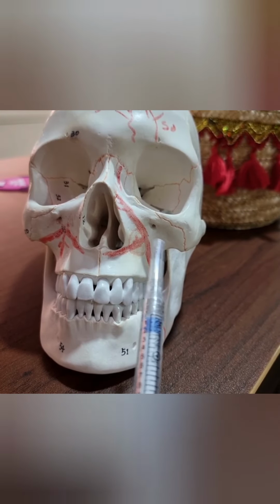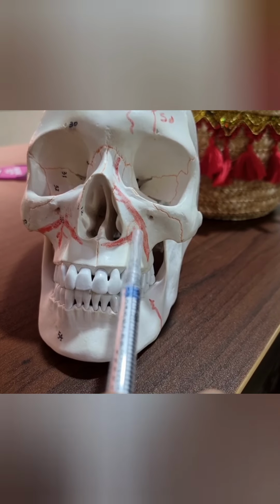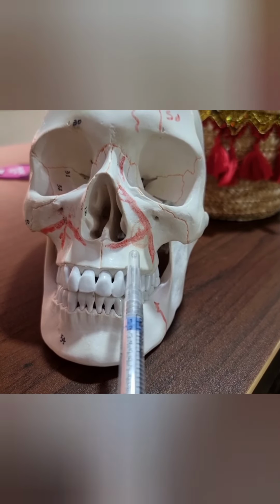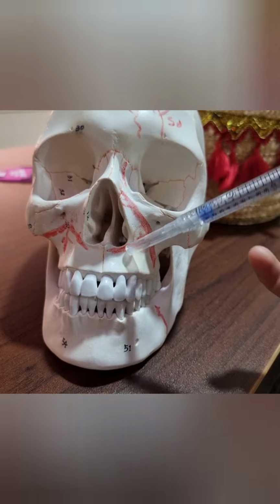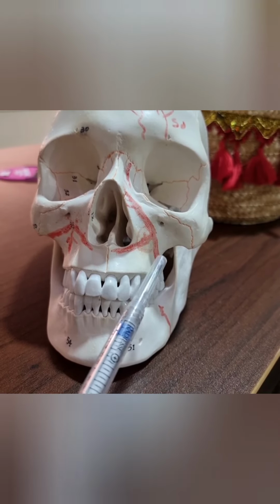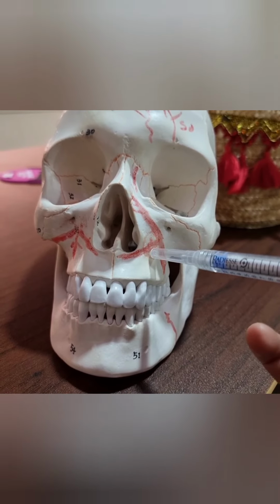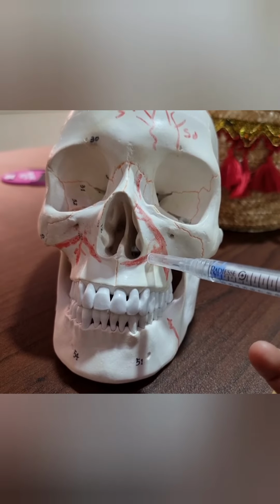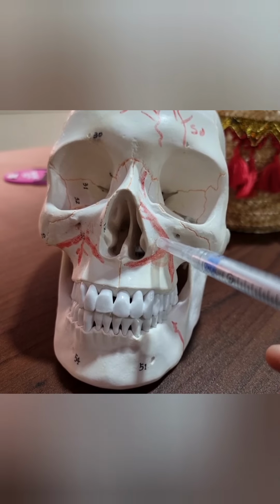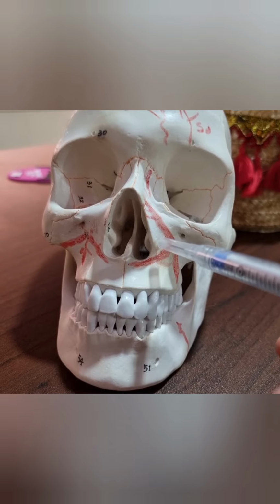Never ever go up, never ever go lateral، علشان ما أعملش hitting للـ facial artery which sometimes sprouts and goes to the lateral side. I must be exactly like that or exactly like that. Never ever have your bevel directed upward or lateral, and this is very important. Your location, rather than the angle of injection, is also very important. Your location must be exactly at this area, not upward, not in the pre-maxillary area. You have to be in the piriform space, not in the pre-maxillary area.